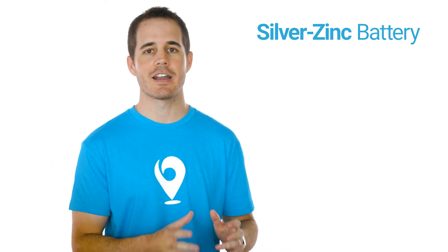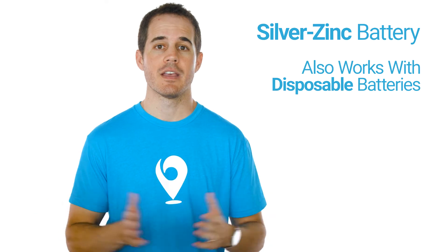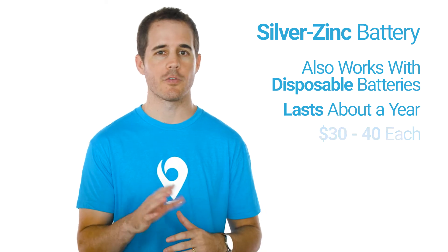One of the nice things about this kind of rechargeable battery is that if you ever run out of power, you can just pop a regular disposable battery in and it'll work just fine. A silver zinc battery will last you about a year, and after that you'll have to buy a new one — usually around $30 to $40 each.